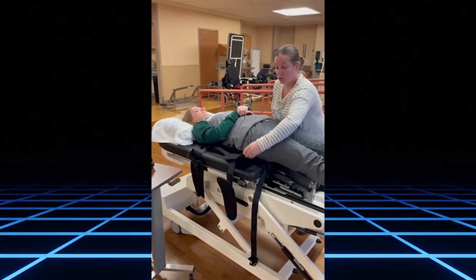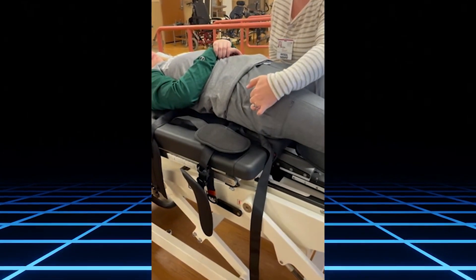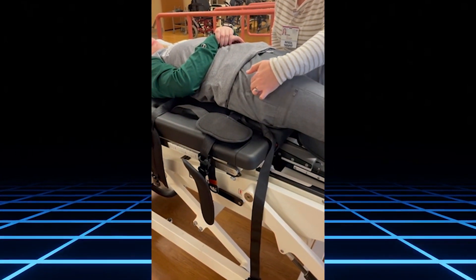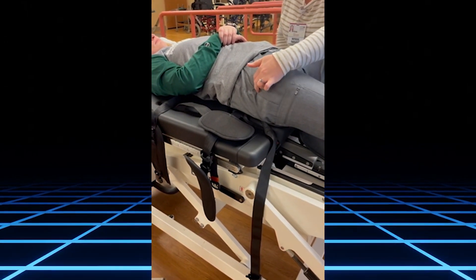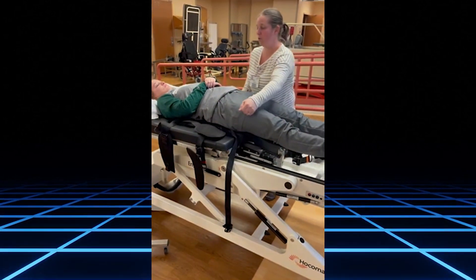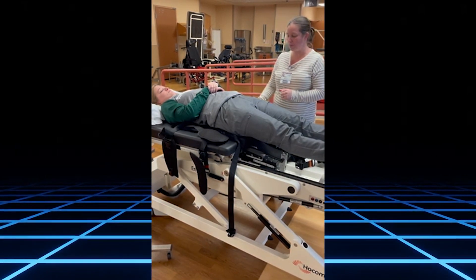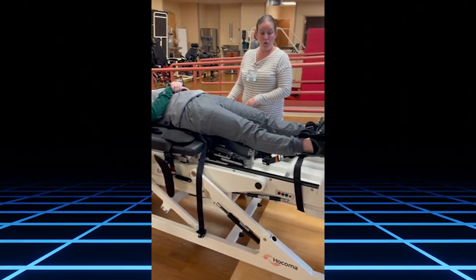You want your patient's greater trochanters to be at this line here. If they are too high or too low, you can have them scoot down accordingly. Oftentimes I will have a sheet underneath so I can pull the sheet if their mobility is not great in order to scoot up or scoot down. So this looks good.